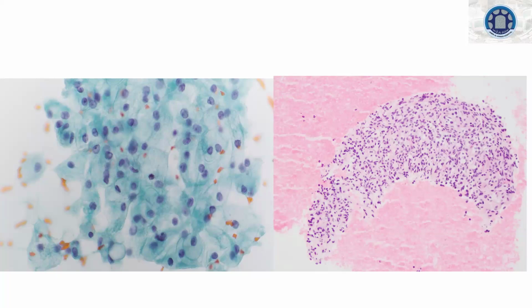No diagnosis, or from lung? Anywhere in the body. It's for residents. It's one of the very common exam cases. No idea? At least one person? Give a wild guess. What can this be?